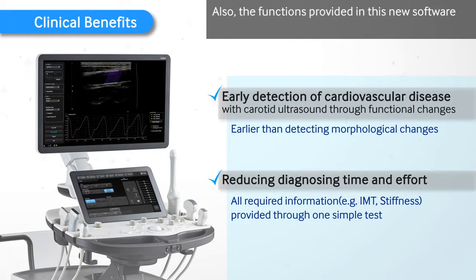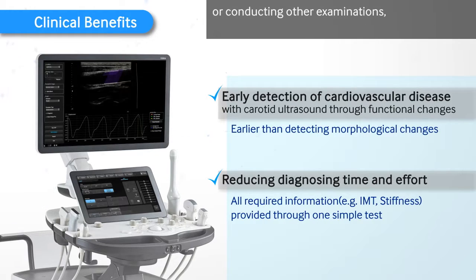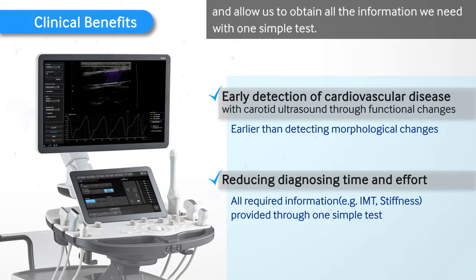Also, the functions provided in this new software save us the effort of calculating the augmentation index separately or conducting other examinations, and allow us to obtain all the information we need with one simple test.